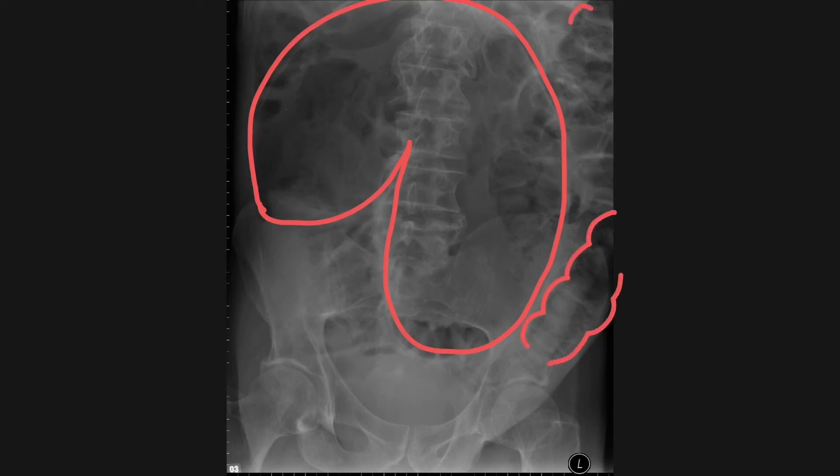we can see these dilated loops of bowel, which have haustra. This is large bowel. And this is the pelvic overlay sign that we mentioned before. And so this is actually sigmoid volvulus. And you can appreciate that it looks quite different to the cecal volvulus.